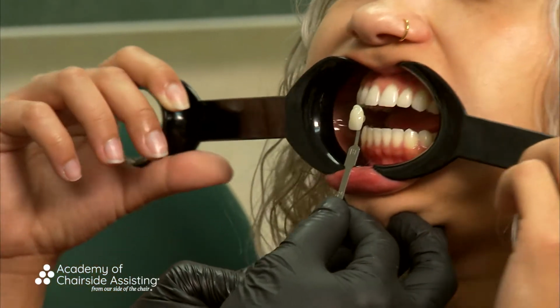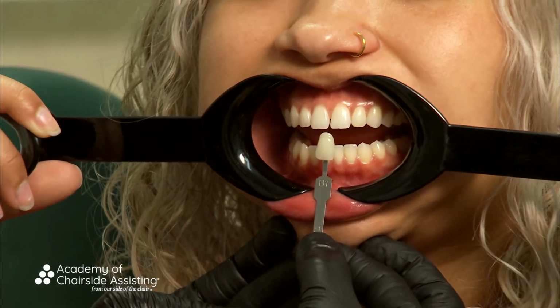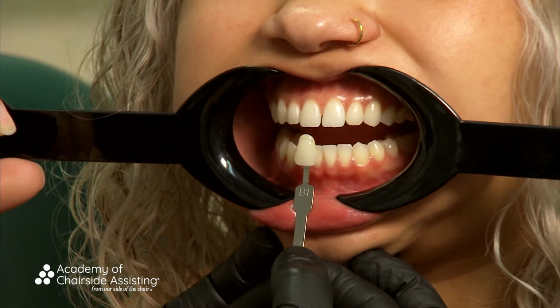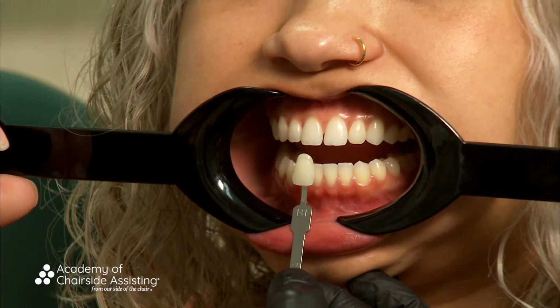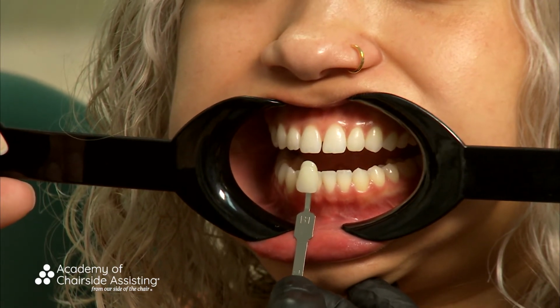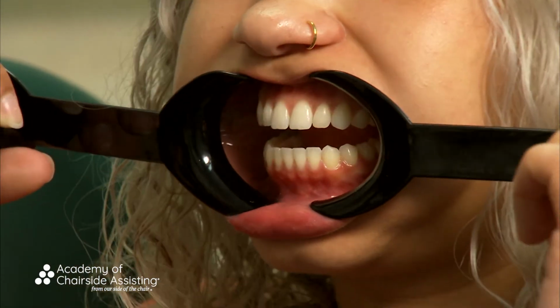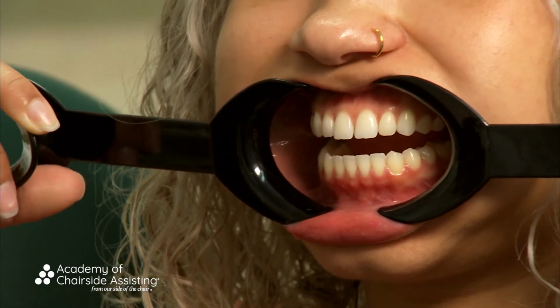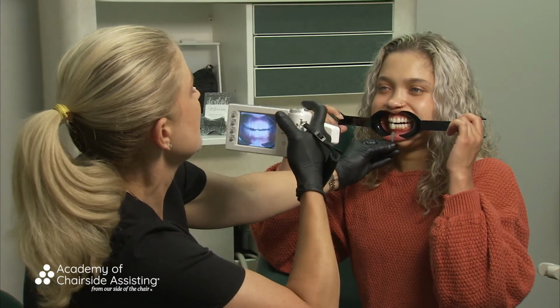Turn just a little bit for the camera there. Let's see if we can just kind of show. This is exactly how I'm going to take my photo. I always want to have that shade tab right underneath the central. And I also want to make sure that I capture the shade. I've had team members before take photos and all we get is the little shade tab, but we don't see the number. And how am I supposed to remember that with the camera? So stay just like that, Haley, for me. And I'm going to just take a quick picture with that shade tab, okay? Stay just like that. Oh, that's perfect.